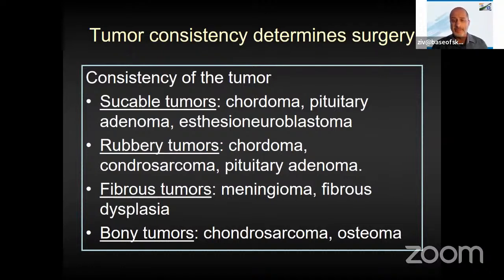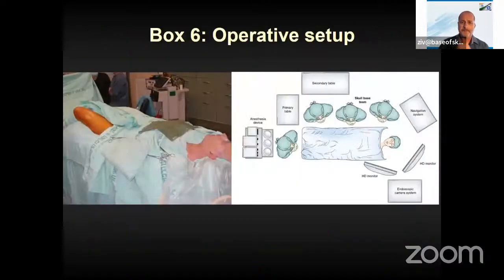And I have a lecture about catastrophic events in endoscopic surgery. Part of them is injury to the internal carotid artery. And obviously bony tumors, as I just discussed before with this osteoma.